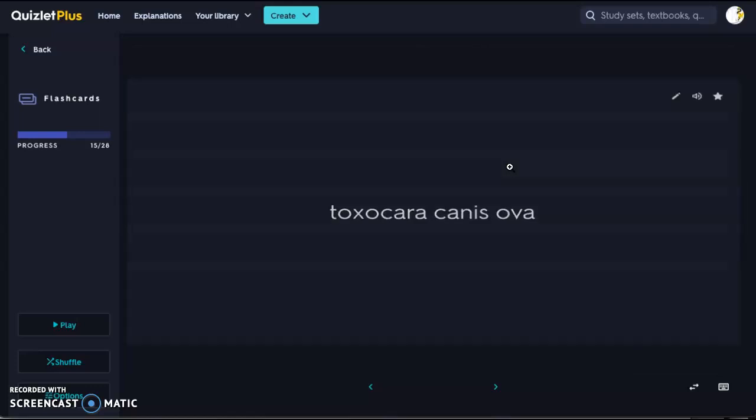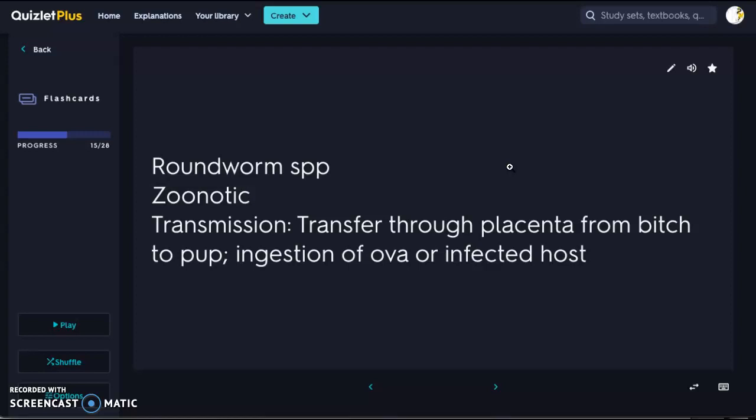Next we have Toxocara canis ova, which is our roundworm species. Roundworms are zoonotic, so make sure you're washing your hands every time you're working with infected animals. Transmission is through the placenta from the bitch to the pup — that's why even if your adult dog has been dewormed, the eggs are hiding dormant and pass through the placenta when the fetus is developing. You can also get roundworm through ingestion of the ova or an infected host, such as undercooked meat.